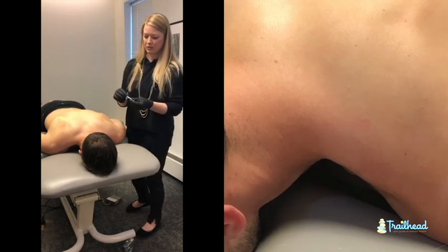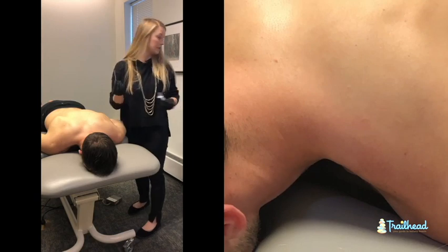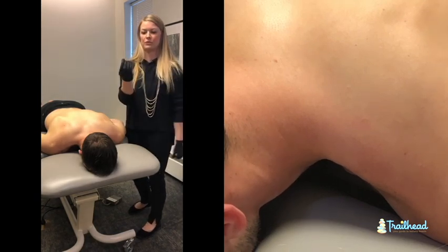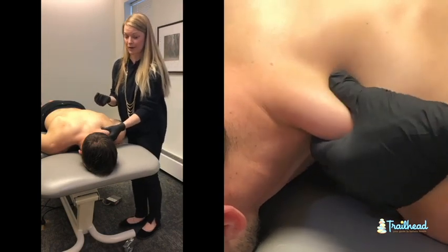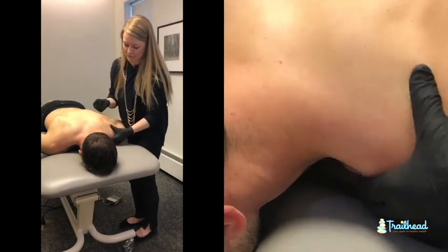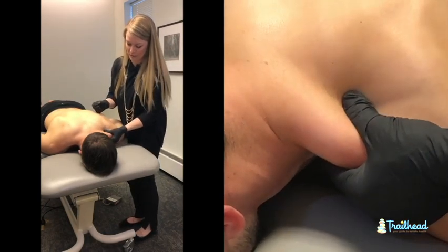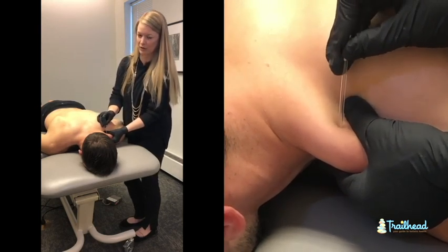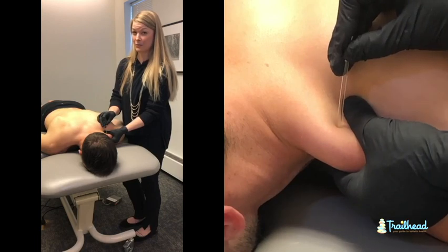I am going to get my needle opened here. The needle sits in a tube and that is for sterile reasons and for insertion. We will go ahead and grab on to Mike's upper trap. We are going to pull it up and away from his body so it is nice and safe. We are going to get our needle in place and I have already palpated or poked on Mike to see where he is tender.